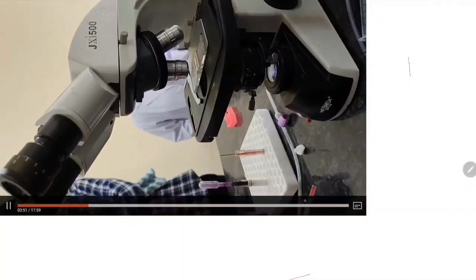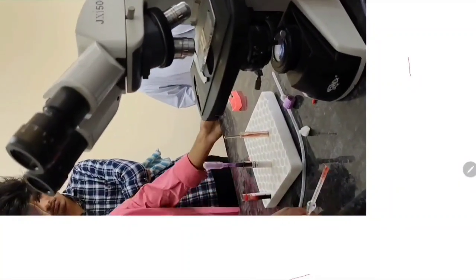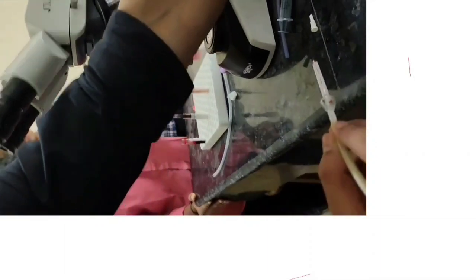So we have already taken the blood, and extra blood is sticking on the outside, so we should just wrap the cotton around the pipette outside and pull downward in one go and take out the extra blood.